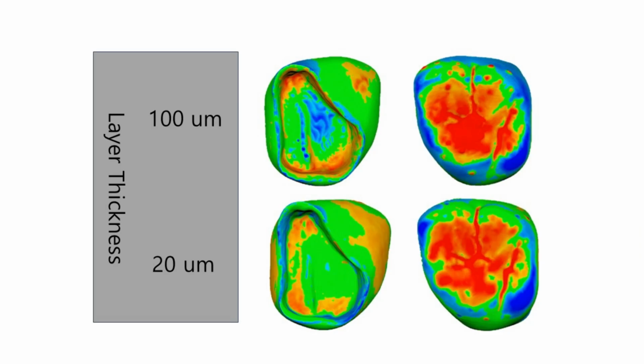This slide discusses the fact that varying the layer thickness does not significantly affect the quality of the 3D printed output. This suggests that, contrary to popular belief, under proper printing conditions, changes in layer thickness may not have a significant impact on the quality of the final output. Therefore, optimization of other setup factors is required to improve quality.